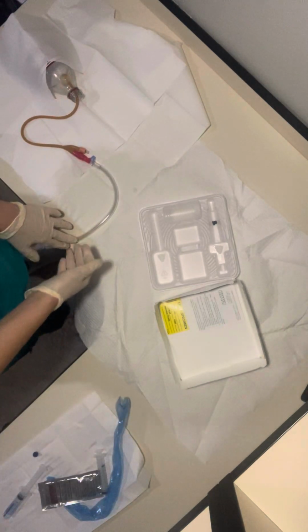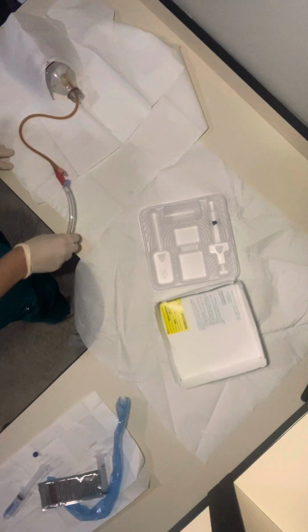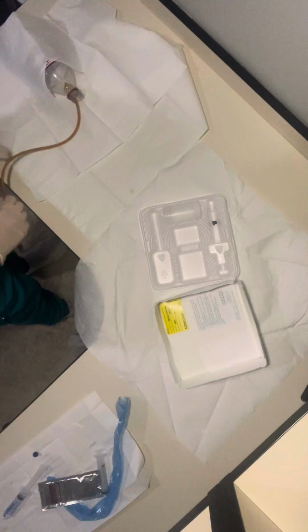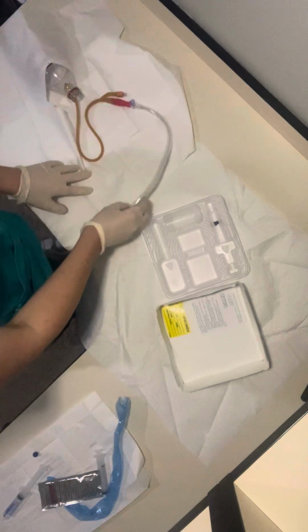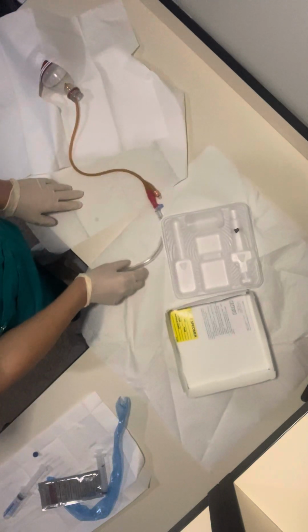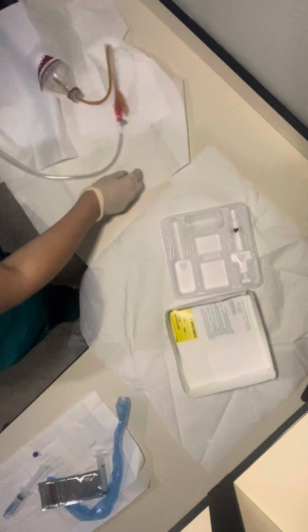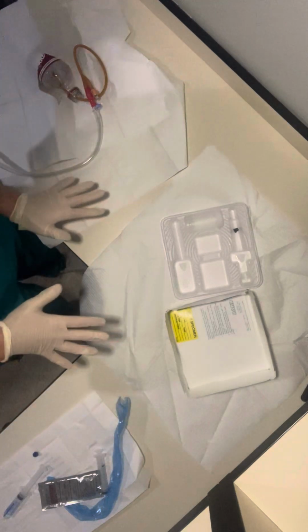I would discard my gloves and my kit and everything, remove everything from the patient at this time. It's not really got a good place to sit. My apologies. Okay, we're just going to lay it right there for now. I apologize. I don't really have a good place.